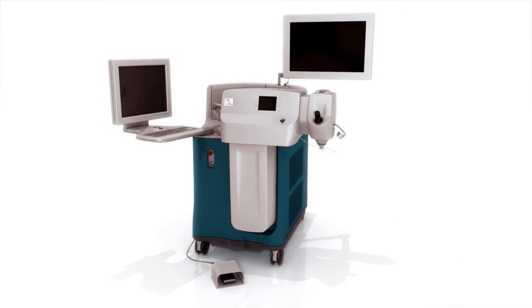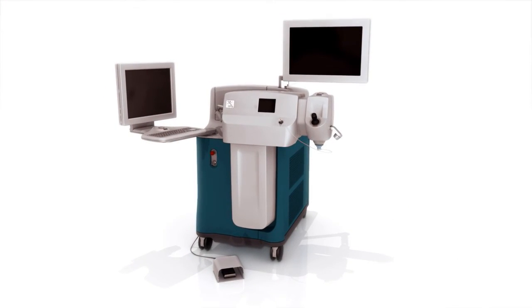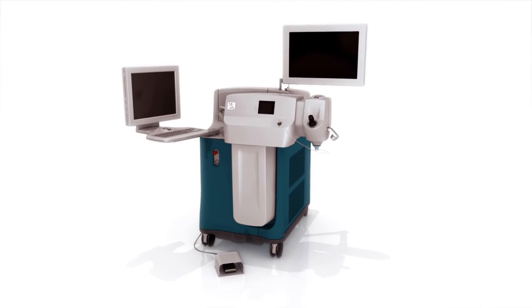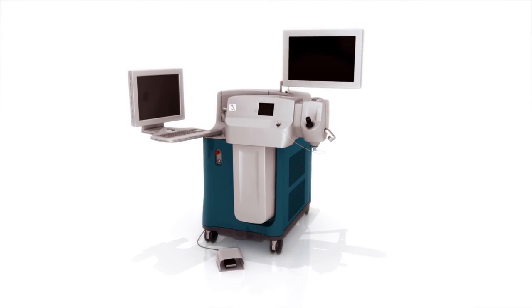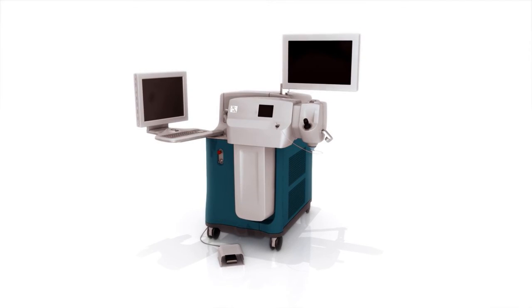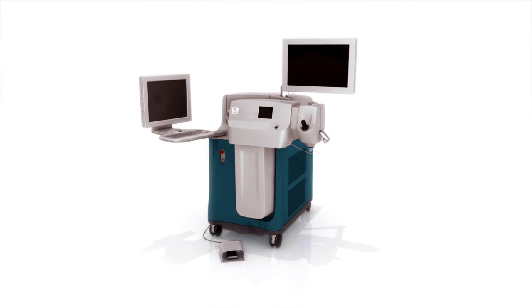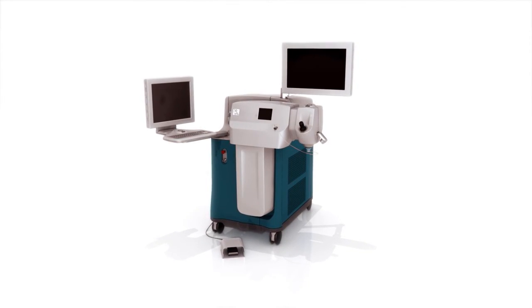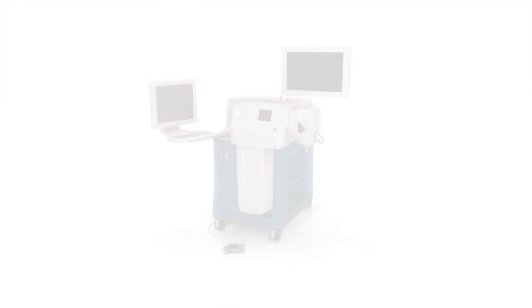Leading a new era of innovation in refractive cataract surgery, the LensX laser is putting the future in motion.